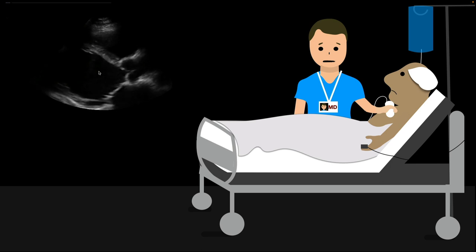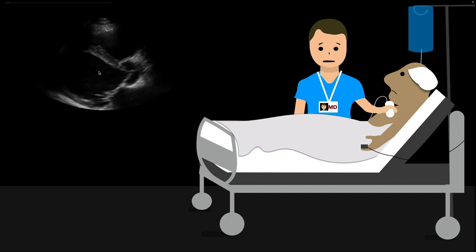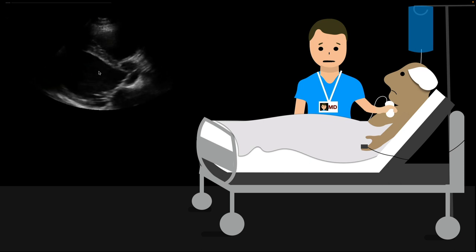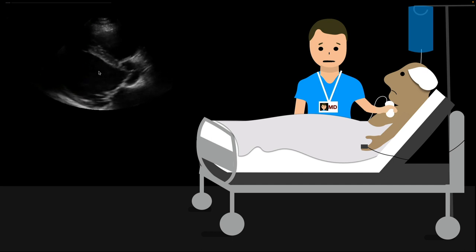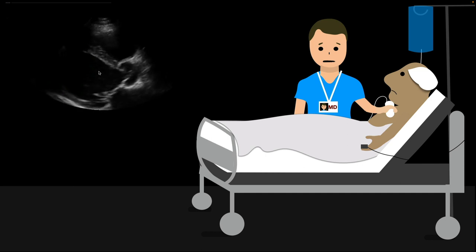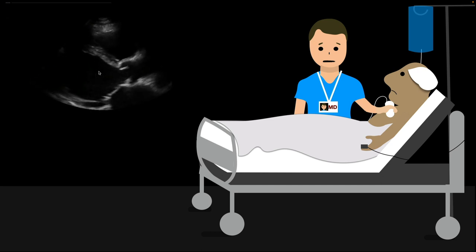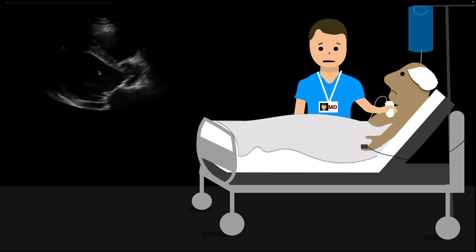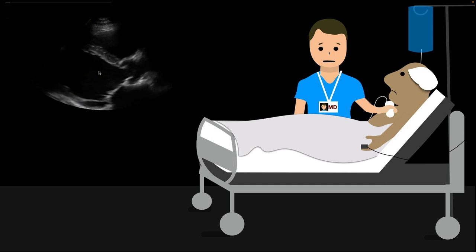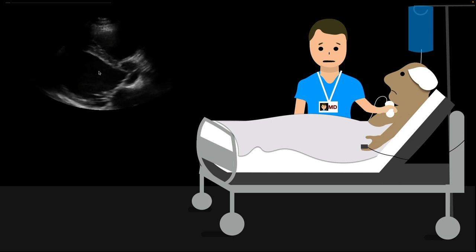Everybody usually says yes — 250 mLs, nobody's ever died from a cup of coffee, right? That's approximately how much volume that is. Then I say, let's look at the heart real quick. I throw this on and show it to them, and they look at it and immediately say they don't want to give that fluid anymore. Even without significant ultrasound experience, they can see this is not a patient in the fluid-responsive area. They're not on the ascending portion of Starling's curve.